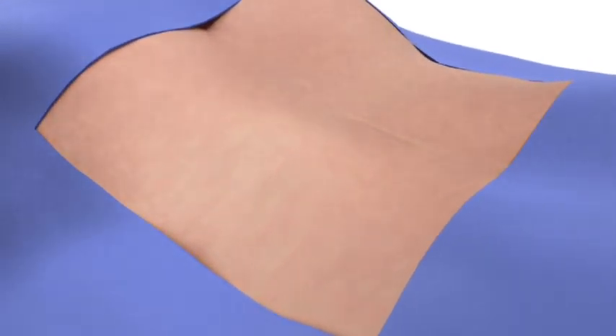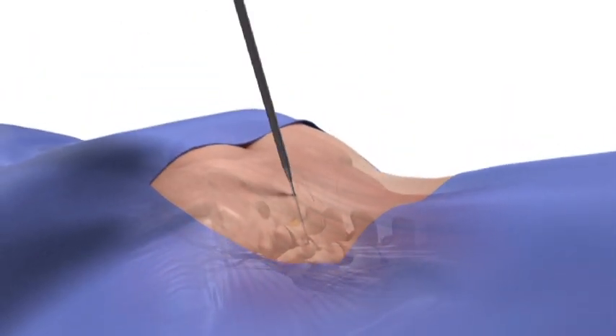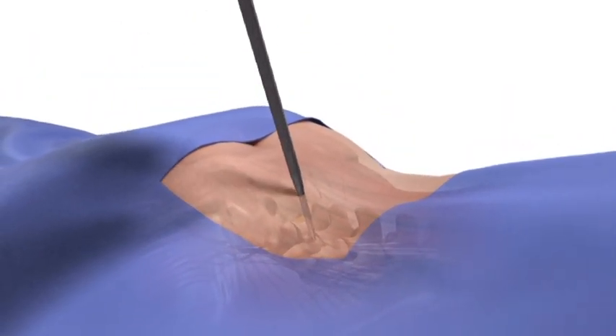To begin, determine the desired trajectory. Insert the guide pin and dock it against the facet joint. Radiographically confirm the location and incline.